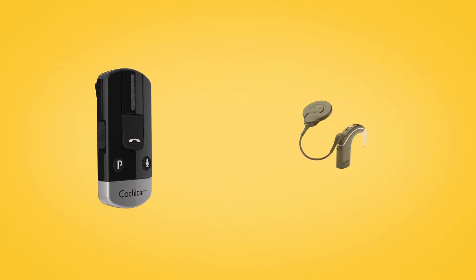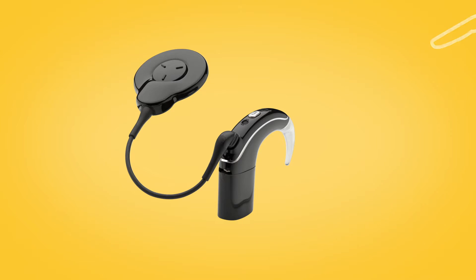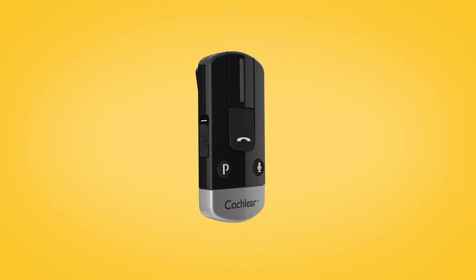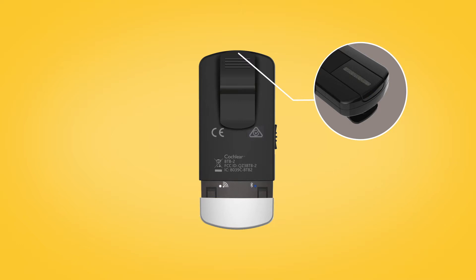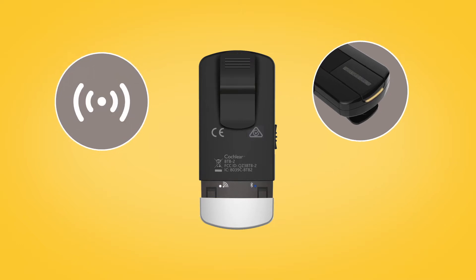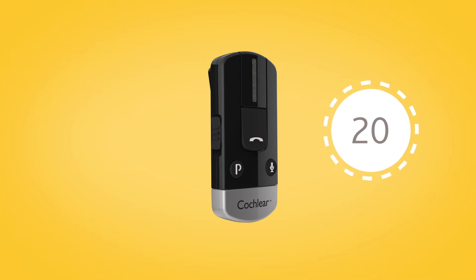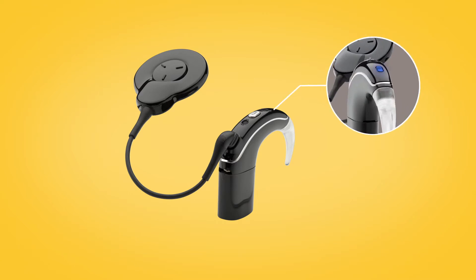To pair your phone clip with your Nucleus 7 sound processor, remove and turn off your sound processor. Then, switch on your phone clip by sliding down the on-off button. Remove the silver cap and use the tip of a pen or similar object to press the white pairing button on the back. The LED on top of the phone clip will flash yellow every two seconds, indicating that it is in pairing mode. Pairing mode lasts for 20 seconds, during which you should switch on your sound processor. Your sound processor will briefly flash a blue indicator light to tell you it has successfully paired with your phone clip.